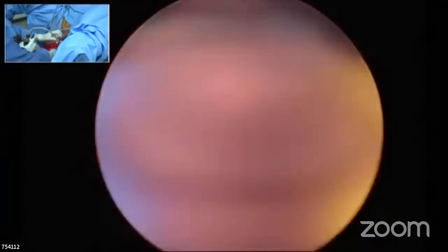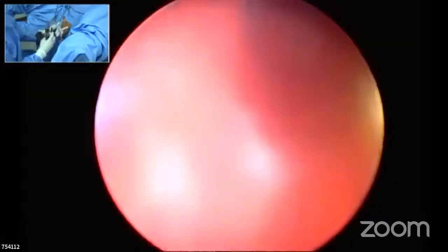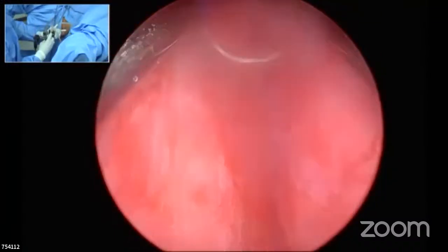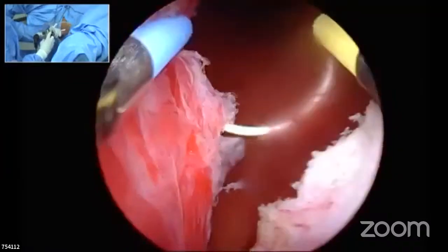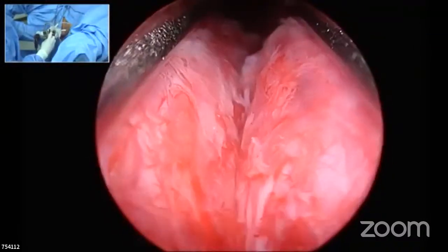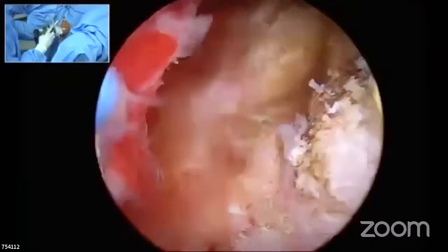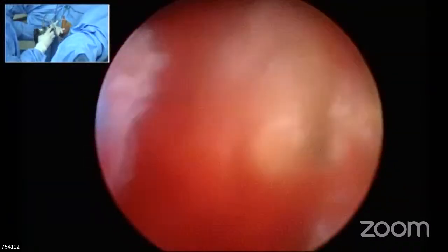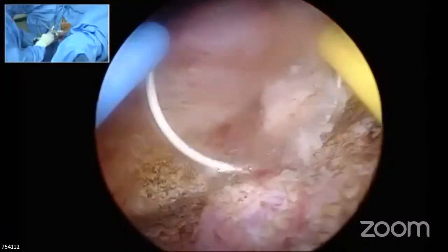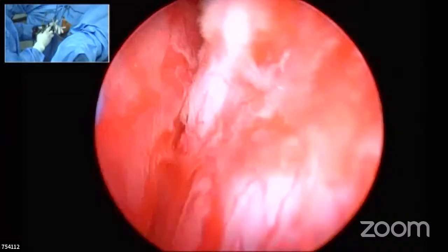The second point. So first coming to the point of how do you cut the prostate? There are 3 to 4 ways of cutting the prostate. Whenever you start the procedure, you keep your resectoscope at the verumontanum and see the measurement of the length of the prostate. So you extend the loop, which extends around 2.5 centimeters. This prostate is more than 2.5 centimeters in length. So in one cut, I can't take out the whole prostate, and that is not advisable also. So either you divide this prostate into 3 or 2 steps. One is I'll take out from here till here, around the first 2/3, and the next 1/3 I'll take at the end, that is the apex, and that area will be taken after this is complete. So that's how the resection is done.